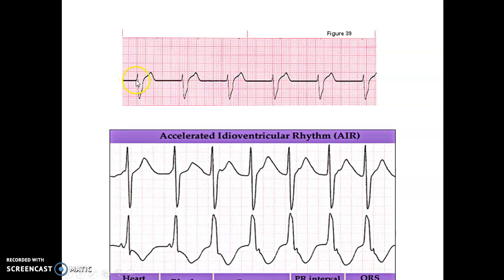My QRS goes up, comes back down, and it looks like it notches or changes directions right there — so that's at least three boxes, meaning 0.12 seconds wide. I also have secondary ST and T wave changes going in the opposite direction of my QRS. So this would be idioventricular, but because my rate is a normal rate of 60, I'm going to call it accelerated idioventricular.